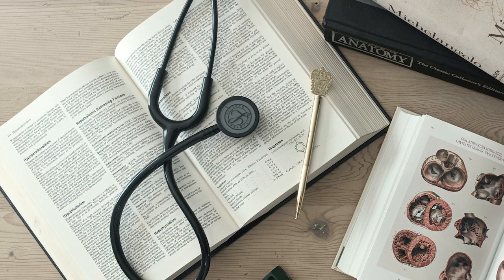This is because conduction through the AV node and ventricles is partial and abnormal, as the ventricular tissue, especially part of the conduction system, is not yet fully repolarized and ready for a normal, rapid pathway. It's like trying to run through a door that's only halfway open and maybe one side opens slower than the other. Okay, wide QRS after the early P.